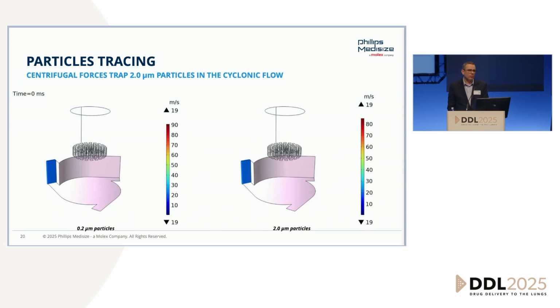Yes. So for these studies, indeed, we've extended the duration of the flow, but you're right, it has an impact. What we notice is that the evacuation is quite good, so all the powder goes anyway very quickly. We've done also some testing with realistic inhalation times, and we were seeing the same things. A thing that's a bit misleading is there are very high-speed images recorded at 10,000 hertz. So you have a lot of frames, and the videos are really slowed down compared to the reality, which gives this impression of length, but it's actually a very fast phenomenon.